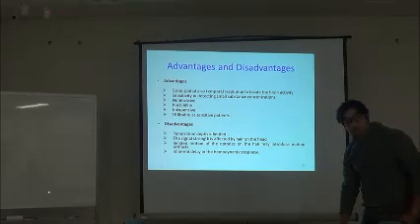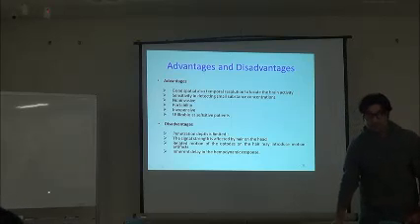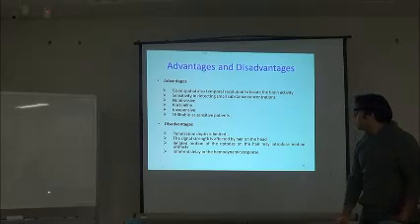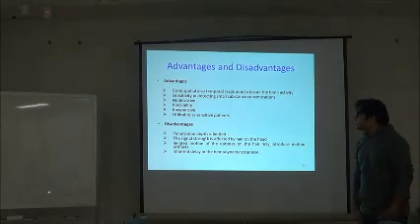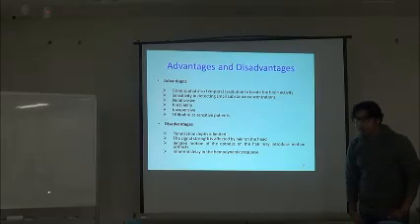Thirdly, it's not very expensive. It is utilizable on sensitive patients like babies, or in some cases on pregnant women. It has no bad effect. It has a good spatial resolution, better than EEG, and it has a good temporal resolution as well, better than that of fMRI.